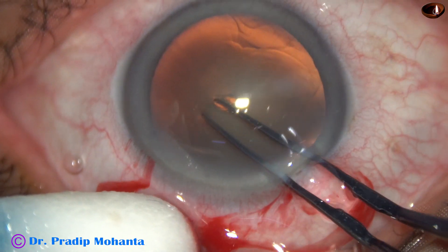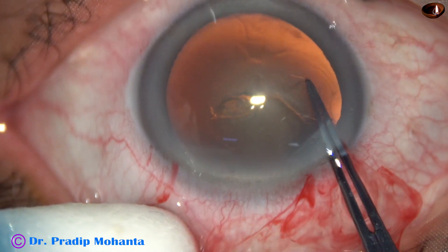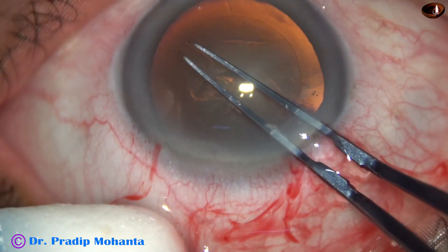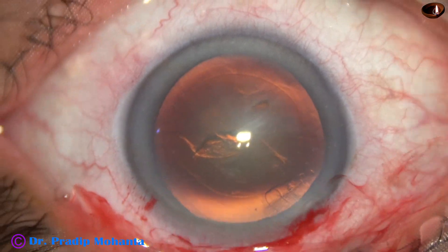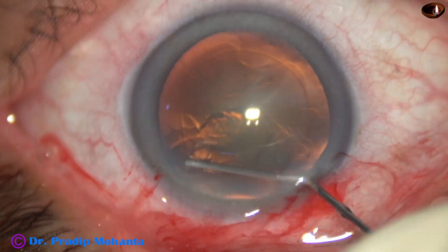And now this is capsulorhexis with the help of utrata forceps. Size of this rhexis is about 5.5 millimeter. This is a fairly round rhexis — adequate sized.